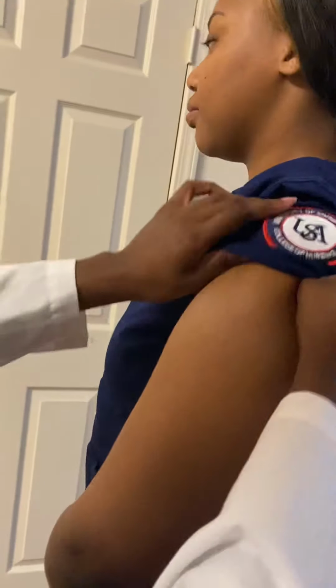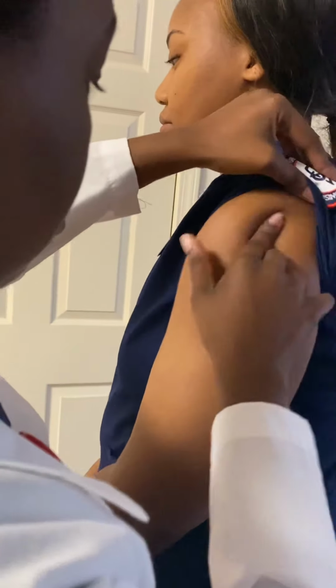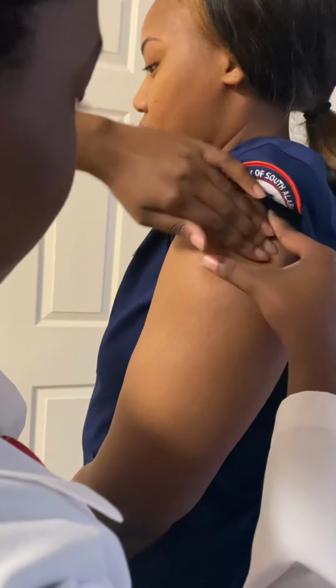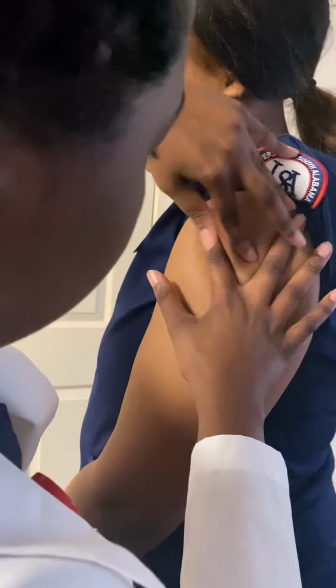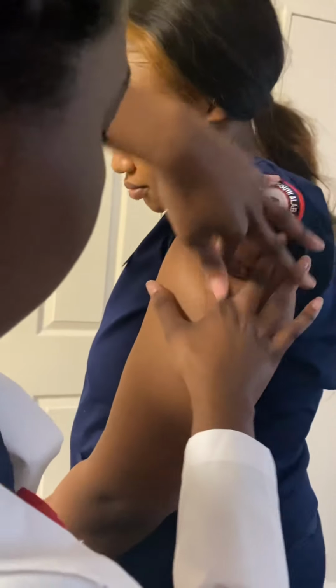And then for the deltoid, I would locate the acromion process, and then I would go 3 fingers down from that, right in between here. And those are my injection sites.